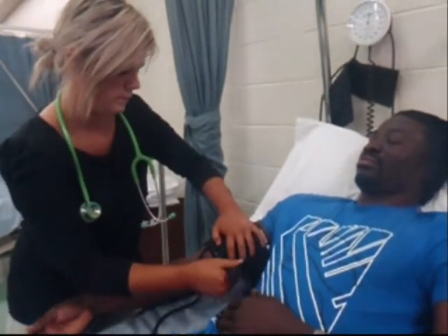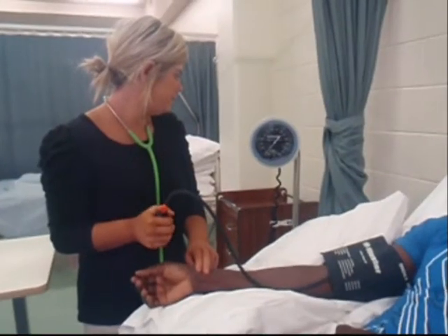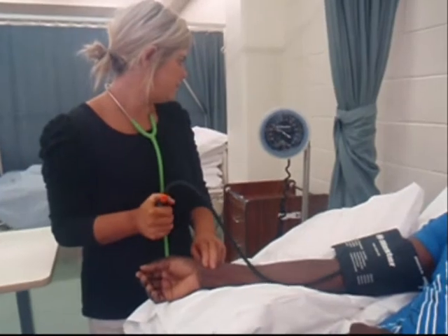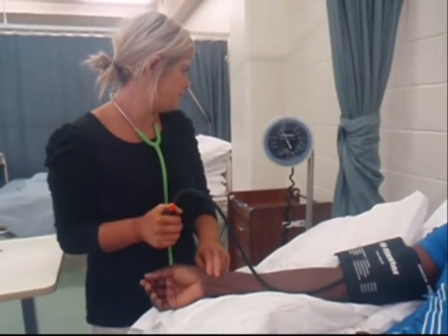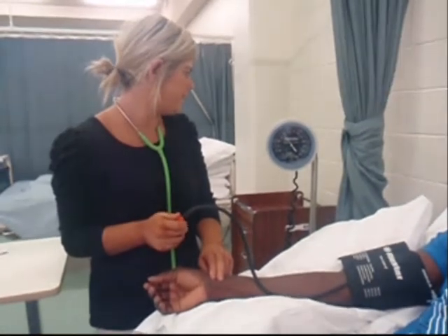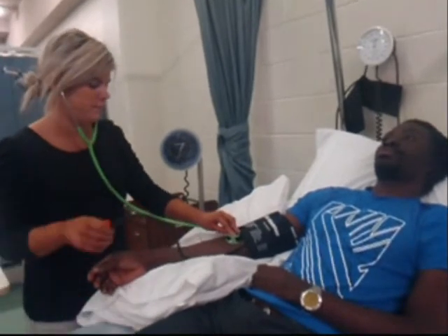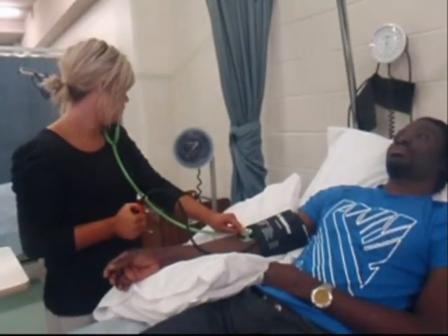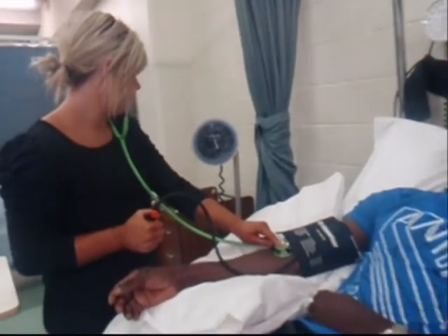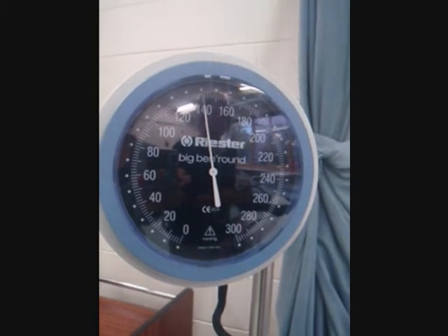With the first two fingers placed on the radial pulse, close the valve on the bulb and inflate the cuff until the radial pulse is no longer felt. Take note of this, as it is the baseline measurement. Deflate the cuff, then place the stethoscope over the brachial artery and begin to inflate the cuff again. While listening to the brachial artery, inflate until you are 30 mmHg above the baseline measurement. There should be no pulse heard.